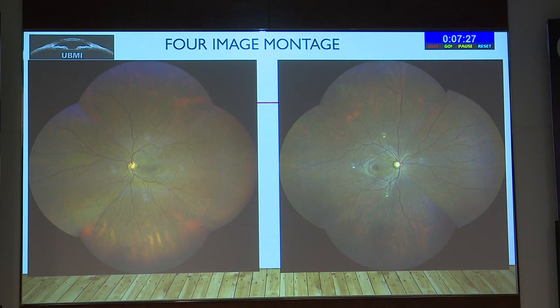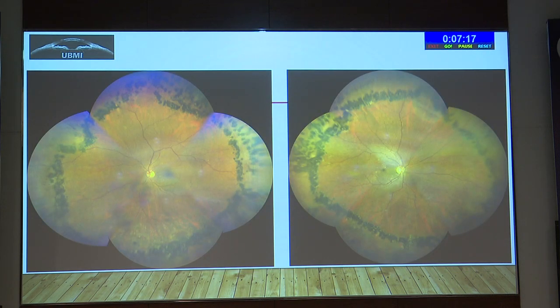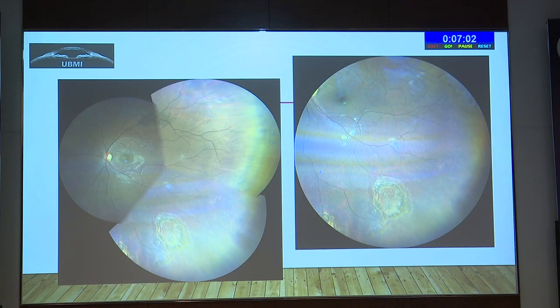And with a 4 image montage, you don't see the montage line at all. It covers probably 90% of the retina, of course not the entire retina, and still it is absolute true color. What you want, we see that. That's the advantage of this. It takes a little time, maybe about 30 or 40 seconds to acquire, but it is accepted very well by the patient, and the color is absolute true to what we want.